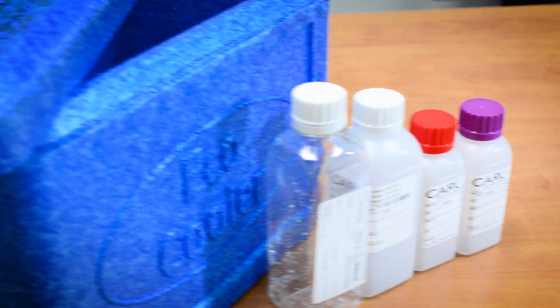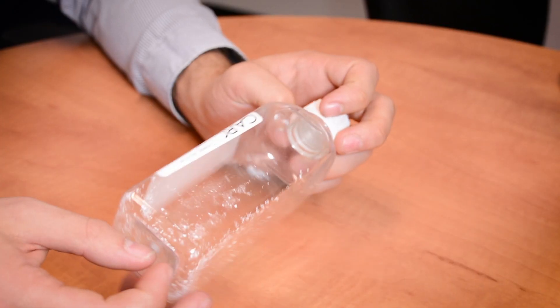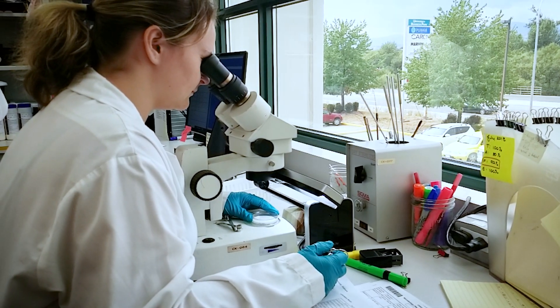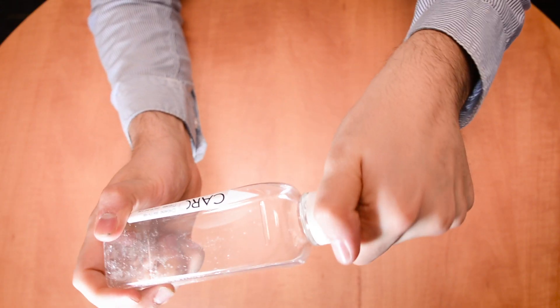You'll receive four different containers. The first container is meant for microbiology tests, including total coliforms and E. coli. All the containers will have a seal to prevent contamination.